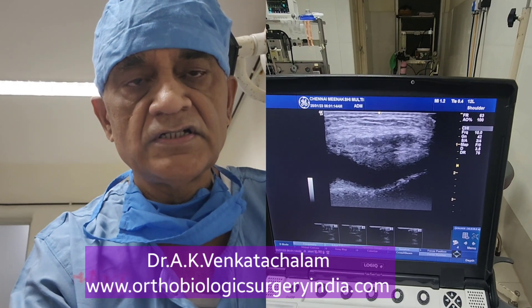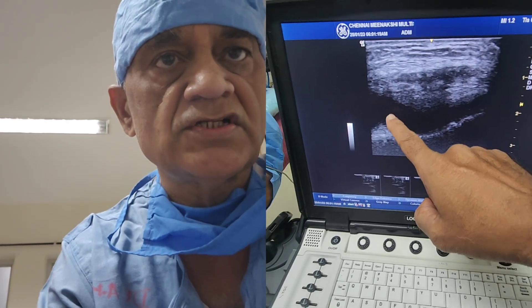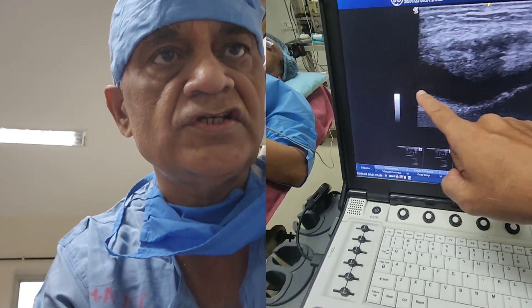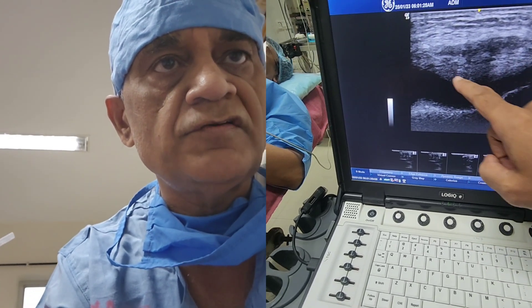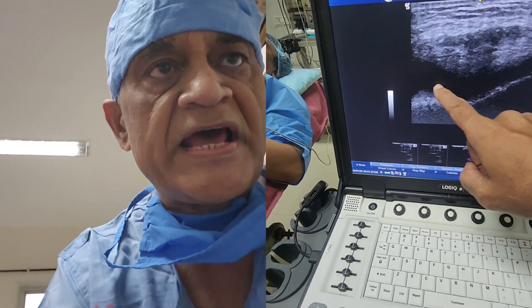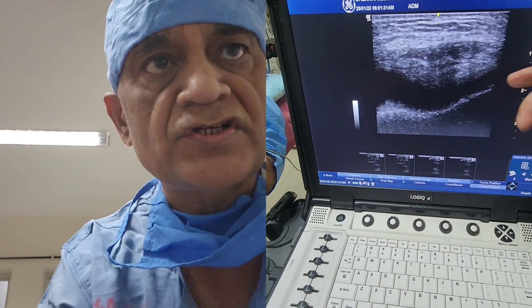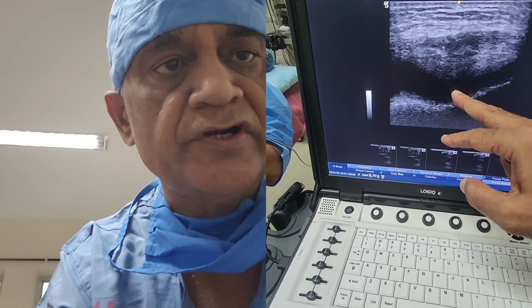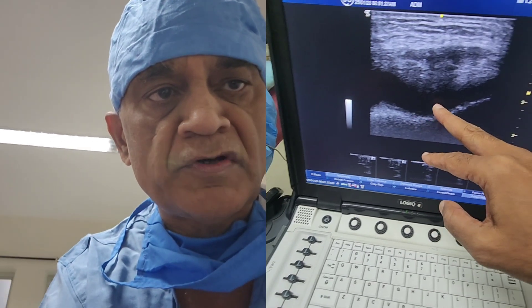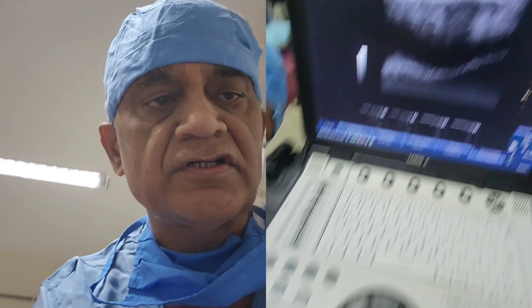The patient is here and this is the ultrasound appearance before the procedure. This is the outline of the femur bone or trochlear. This is the outline of the patella bone, and this black area which you are seeing here is the effusion. There is plenty of effusion. I will be inserting a needle from here, withdrawing this fluid, and injecting stromal vascular fraction and PRP. The combination is known as PRS into the knee joint.